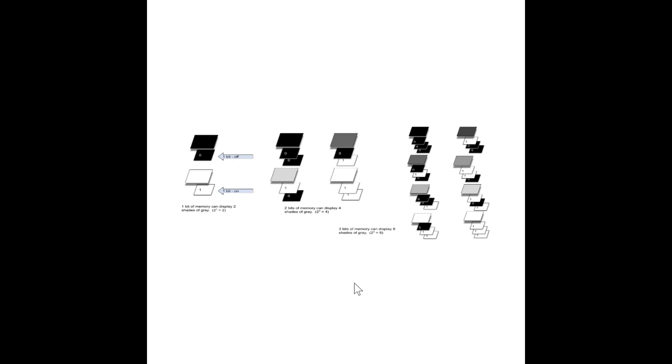So by knowing how binary numbers work, we can see then how the bits are assigned either a 0 or a 1, and then by adding bits together, we can make more shades of gray. And when there's a finite amount of combinations of the bits, that means there's a finite amount of grays that can be displayed per the bits available. So by turning a bit on or off, the pattern it makes with the other bits are going to make new numbers, therefore making a new shade of gray.